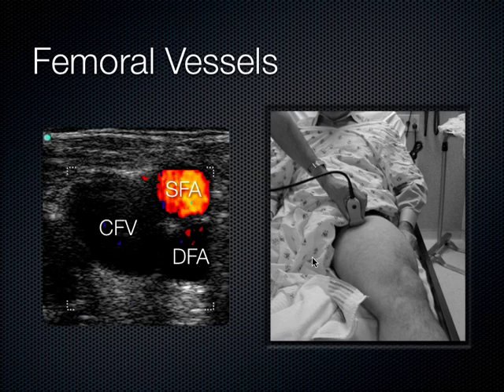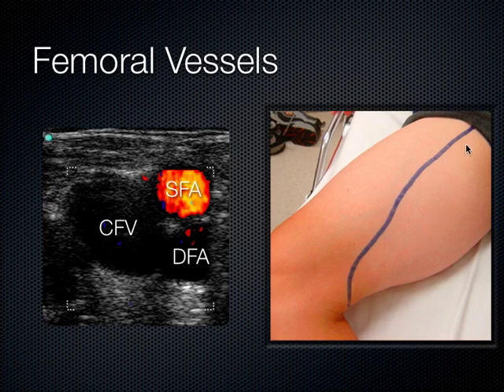Very good, the left leg. The other way you can look at it up here, the picture, they're scanning the patient's left leg. Very good, excellent. And so what's happening is this femoral vein I drew here on my fellow comes down his leg here, and it was a little bit awkward, but it comes down his leg and dives in the superficial femoral canal. This is where it's really hard to insonate or to view.